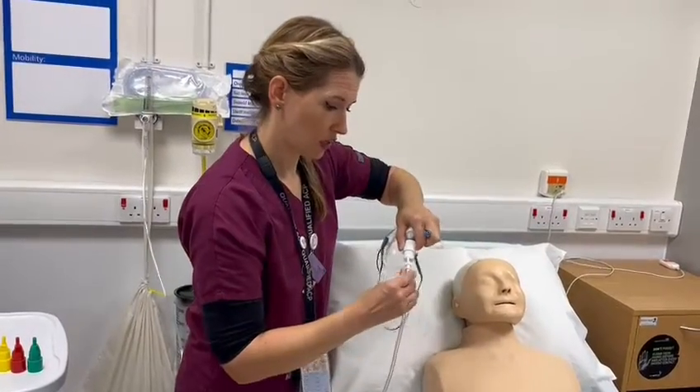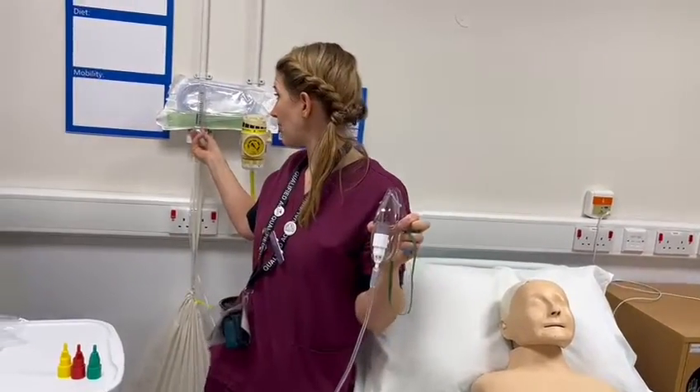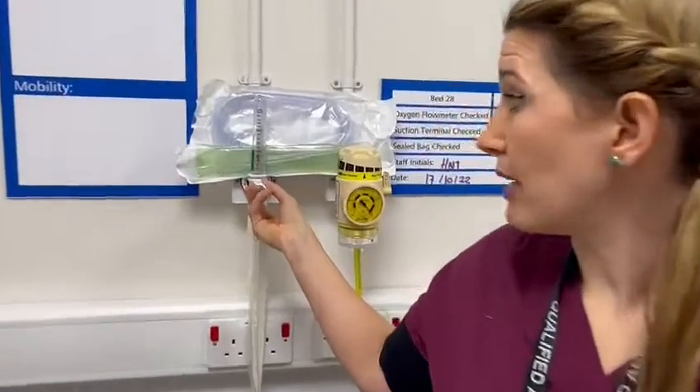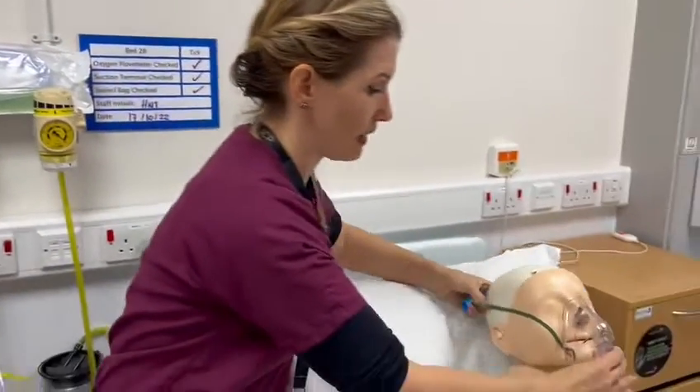Make sure you give it a good press, make sure you've got four litres — again making sure the black line is in the middle of the ball — and then pop that back on your patient and recheck their oxygen saturations with a sats probe.